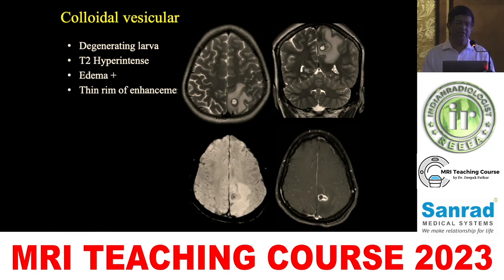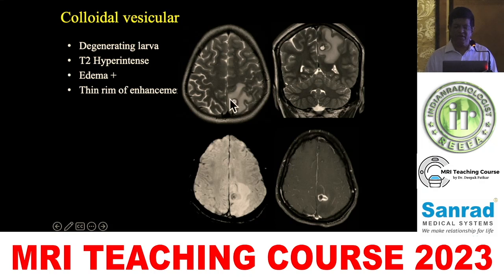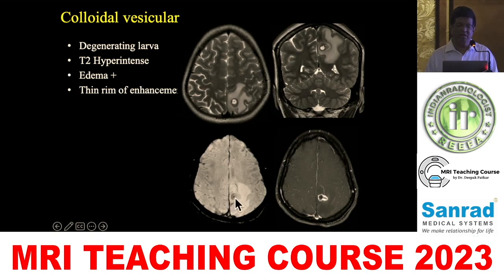The next stage is when the patient presents after the cyst starts rupturing. A ruptured cysticercus is dark on T1, bright on T2, with a thin dark capsule and a small eccentric scolex. There are two daughter cysts and a lot of edema. Gradient imaging will show some blooming of the capsule and the scolex.